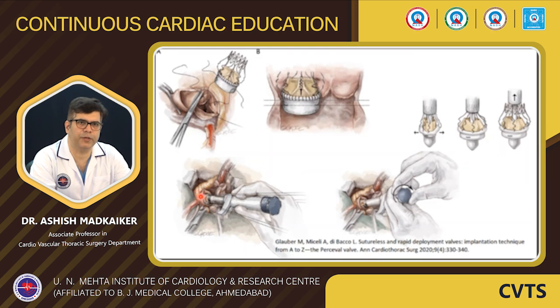Now it is very important to direct this valve in the LVOT in the right position so that it deploys in line with the LVOT. Once we are happy with the position, we then rotate this knob in a clockwise direction so that the valve gets deployed. Once the valve is deployed, we will close the aortotomy and follow the same steps of coming off bypass, decannulating, and closure of the chest.